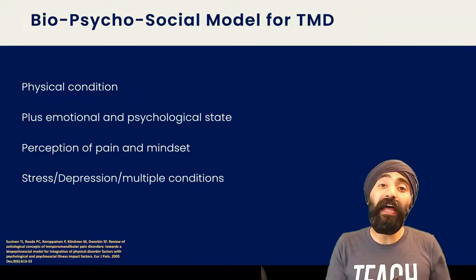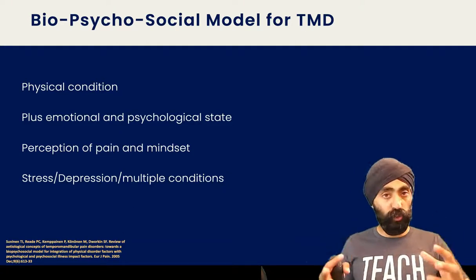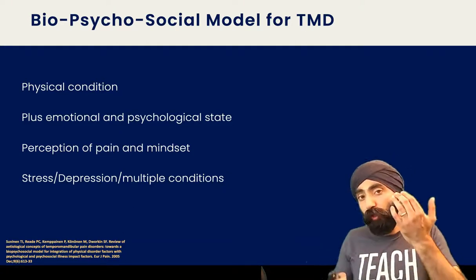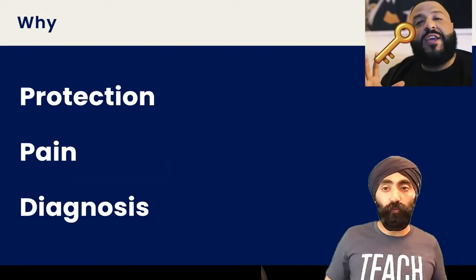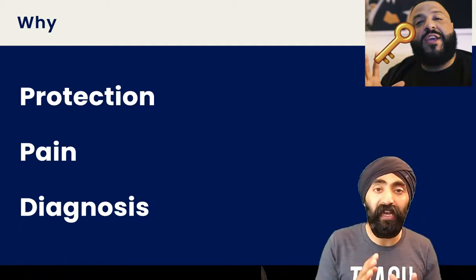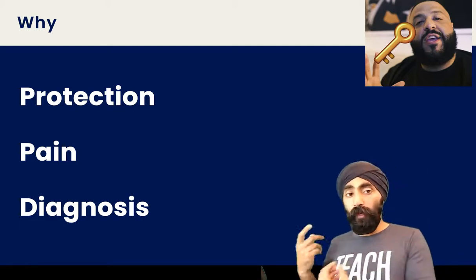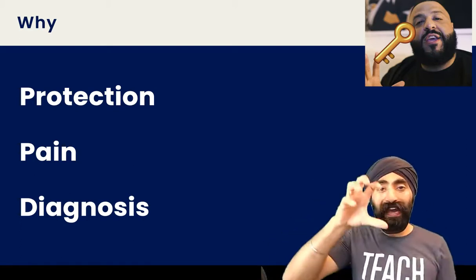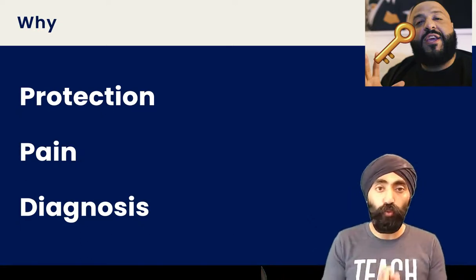So I just want to put that in there because I can't possibly cover a little bit of occlusal appliances without touching on TMD. Now we're going to refocus back on splints and just cover something very fundamental, right? So I've got DJ Khaled there because this is a major key alert, okay? People get very wound up about appliances and prescribing appliances. We need to boil it down as to reasons why you would give an occlusal appliance, okay? Just back to basics, why, okay?